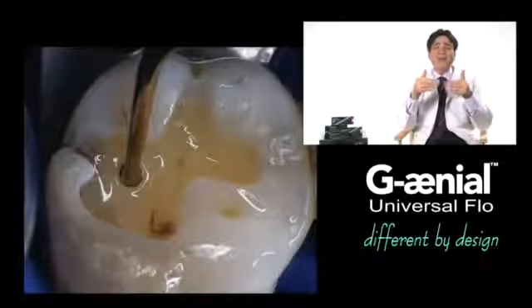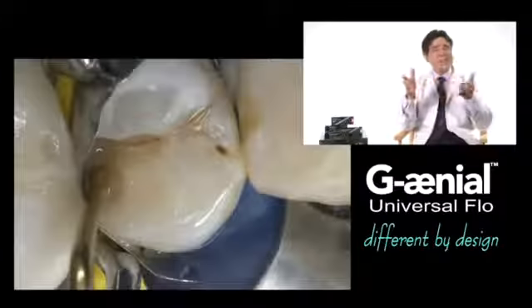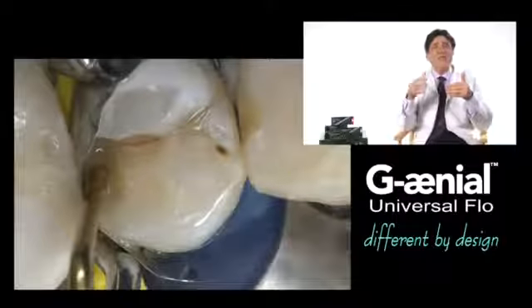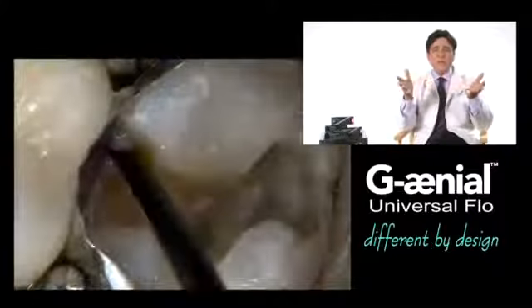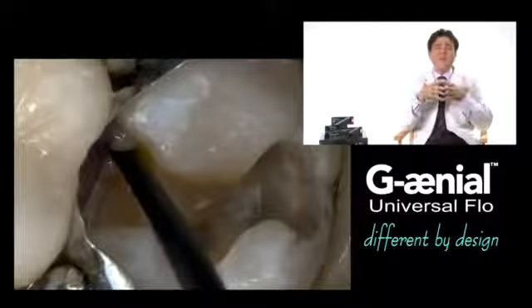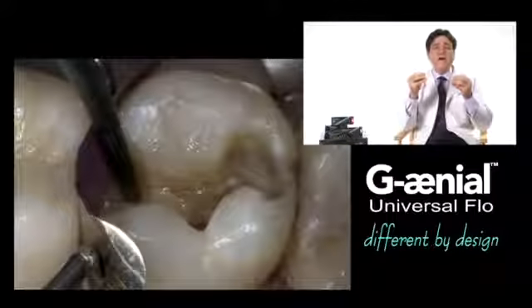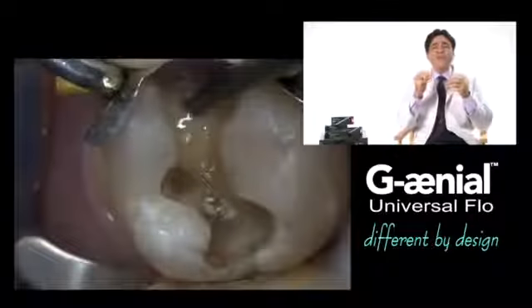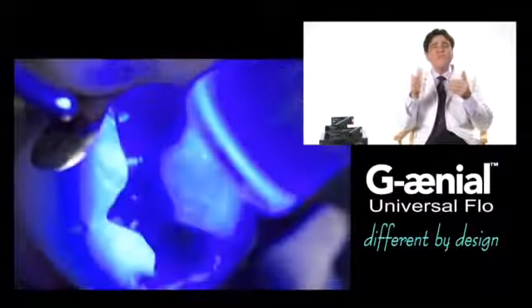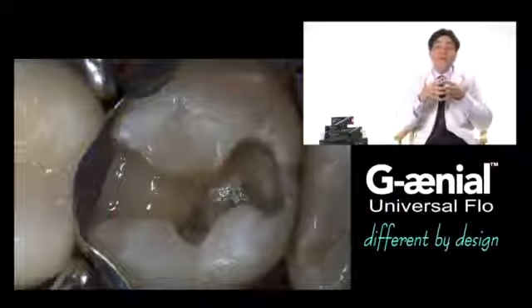The low modulus composite acts as an elastic buffer that compensates polymerization shrinkage stress by flow, eliminating mastication discomfort and theoretically eliminating cuspal deformation or gap formations and reduced microleakage. Also, the flowable materials may enhance the wetting capacity of the restoration, resulting in a more complete interfacial internal adaptation, reducing void formations, which can contribute to a weakened surface and microleakage.